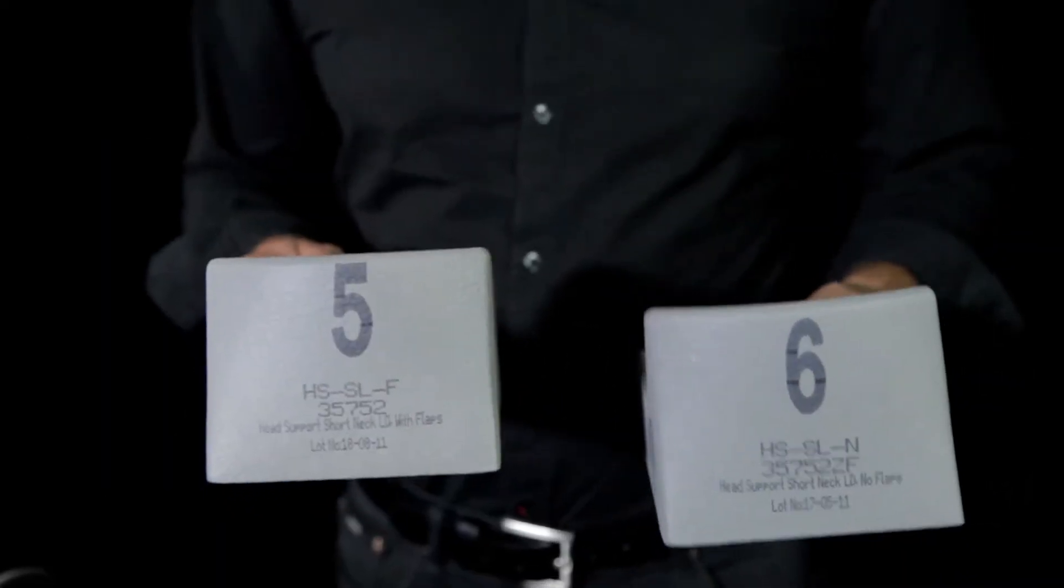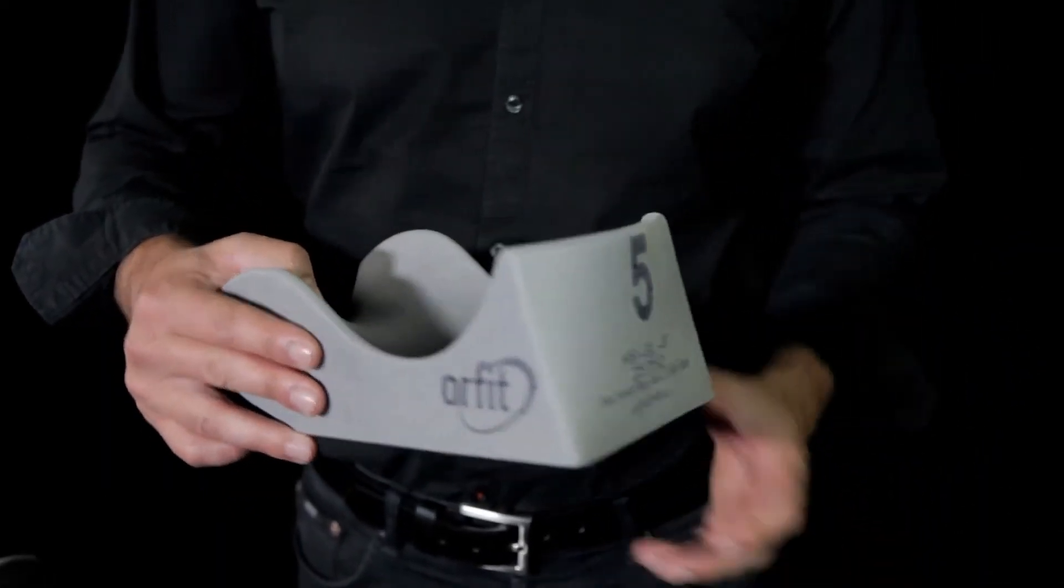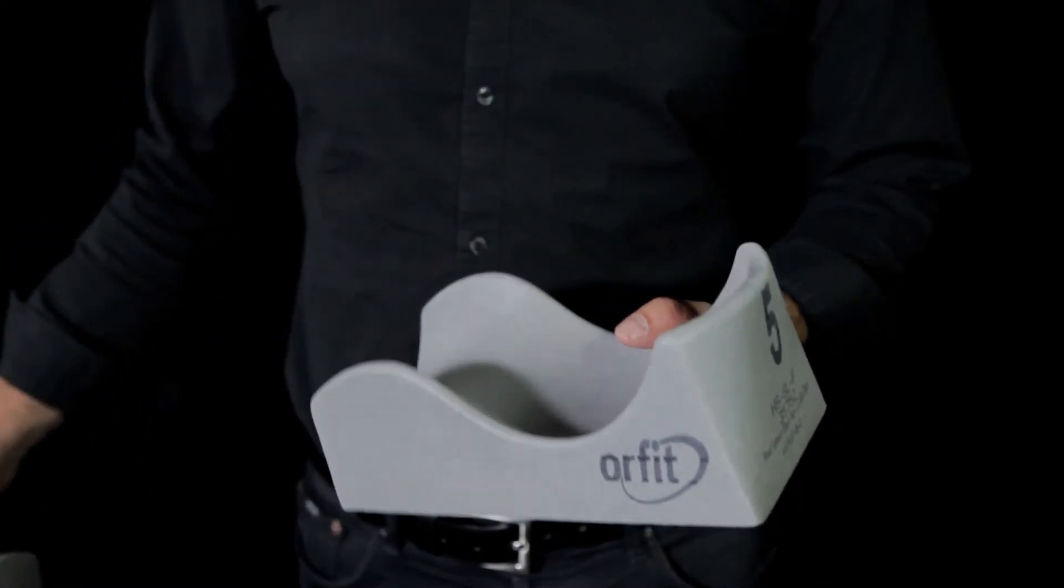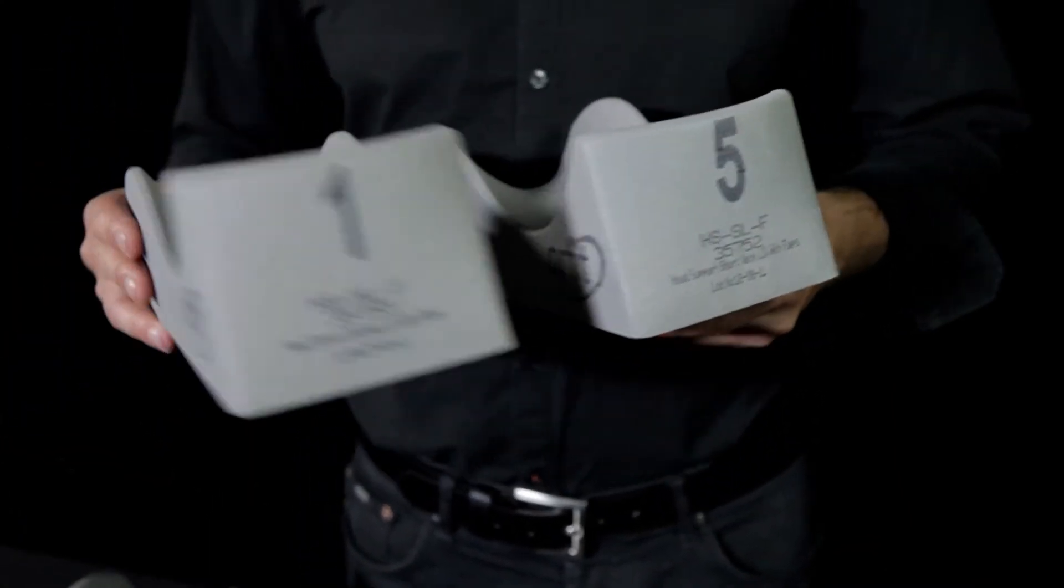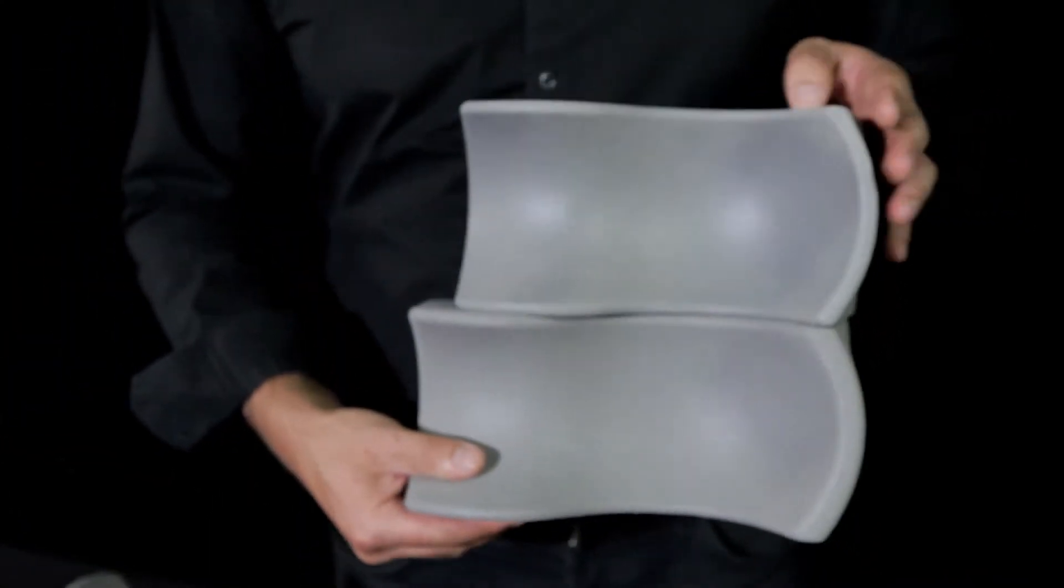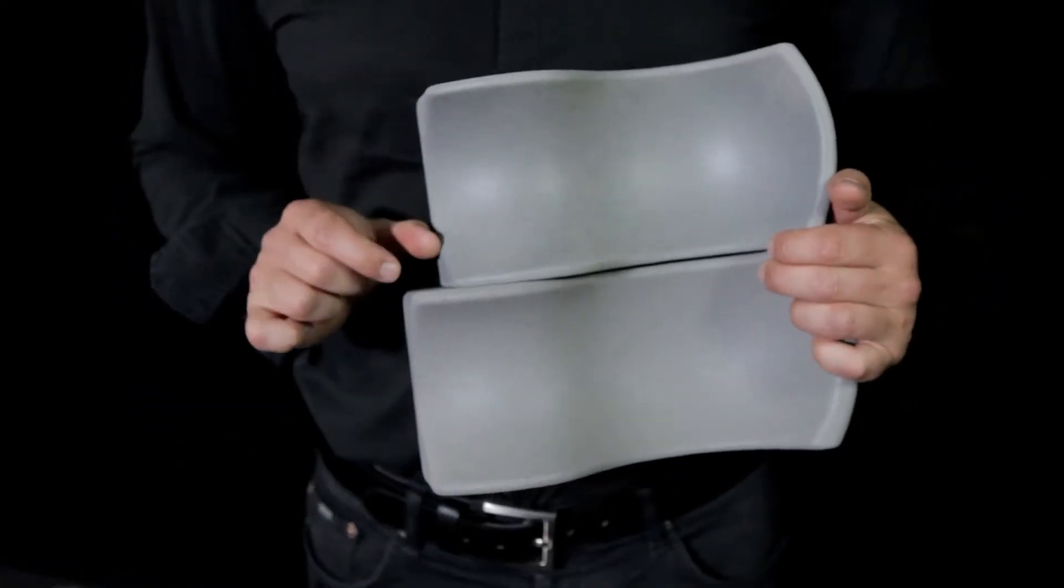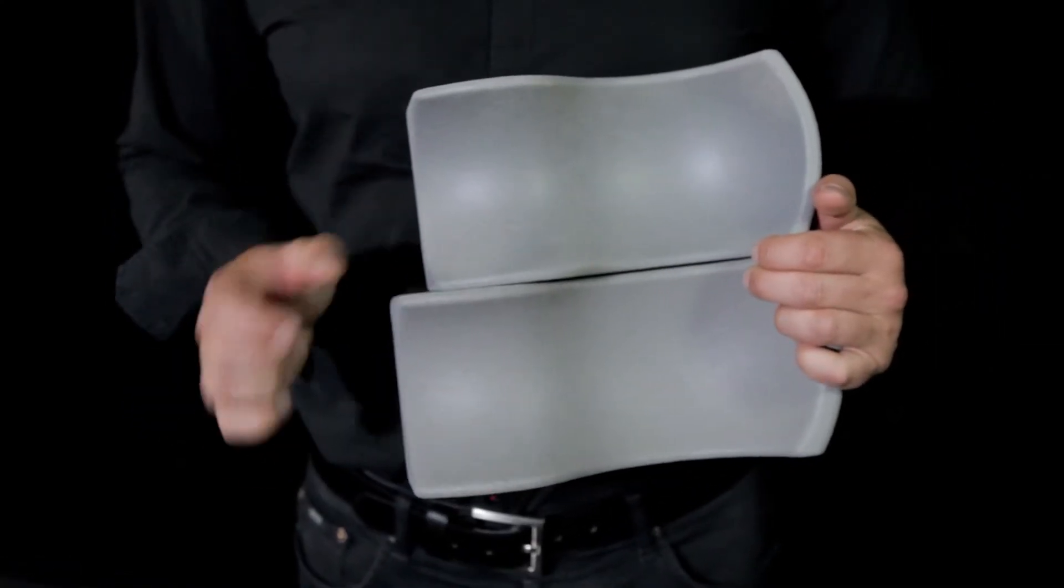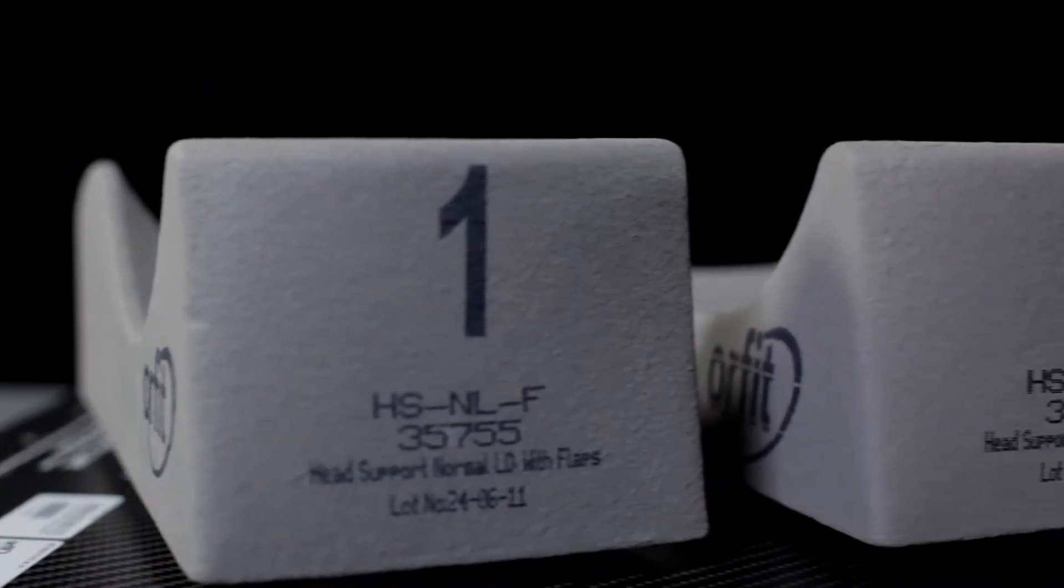And finally, head supports 5 and 6 are just as big as supports 1 and 2, but slightly shorter in the neck section than models 1 and 2. They're used for patients whose head is closer to the shoulders without a distinct neck.